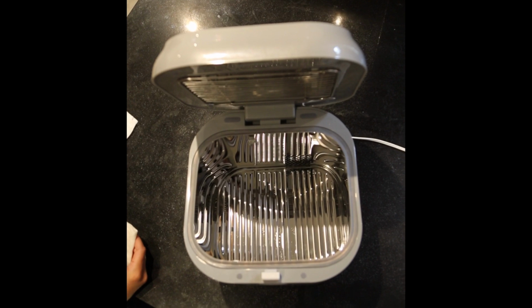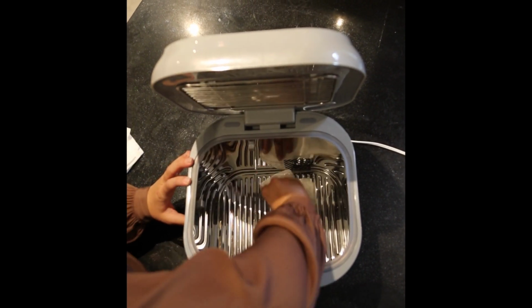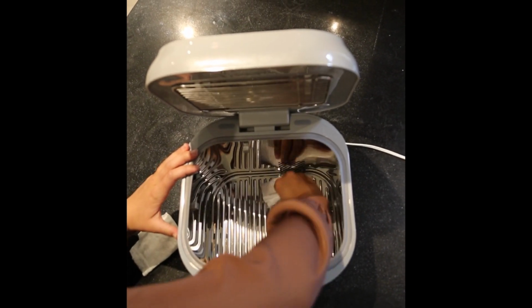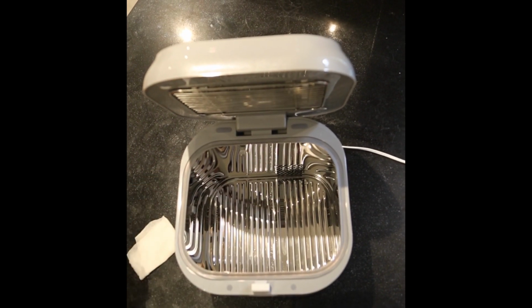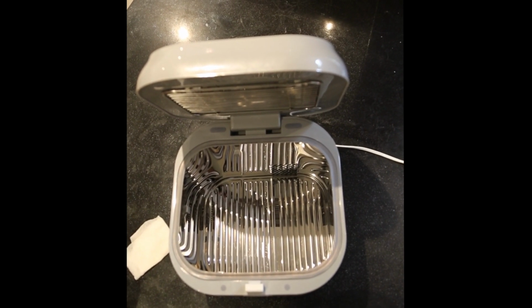As a part of regular maintenance, make sure you wipe any watermarks you see with a wet paper towel. Then use a dry one to wipe it. If the watermarks are light enough, you may be able to just use a dry one, but make sure you don't use any vinegar or chemicals on the machine.